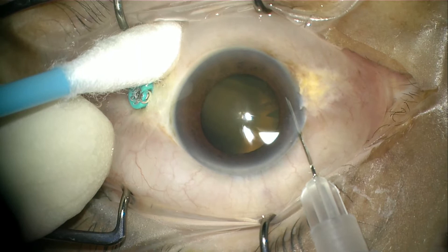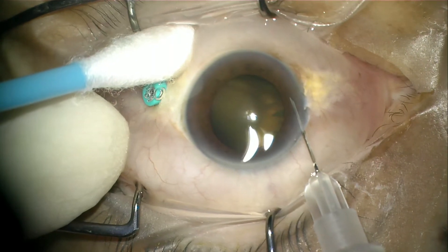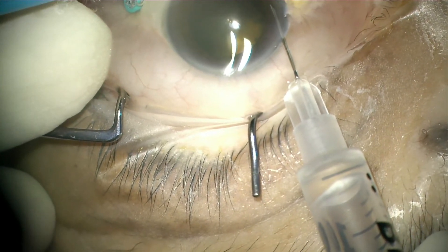I frequently do it without the plunger as I feel it is easier to control. One hand will be holding the syringe and one hand will be holding a cotton bud. The direction of the needle has to be tangential, and the aim is to keep the tip of the needle resting on top of the iris tissue.